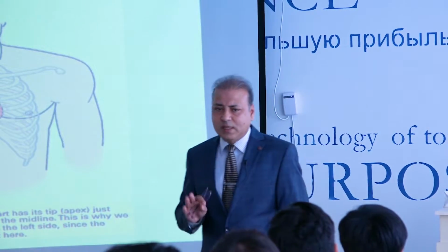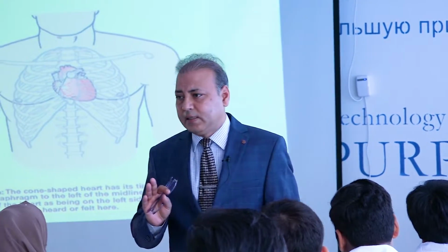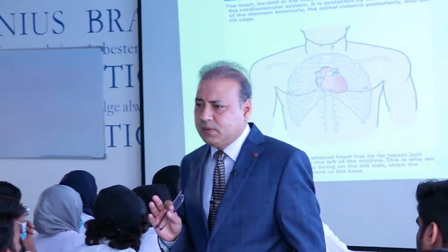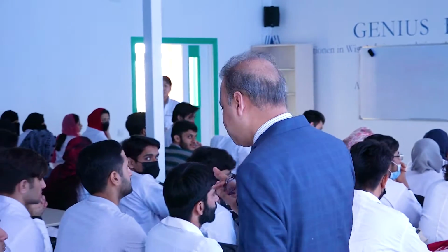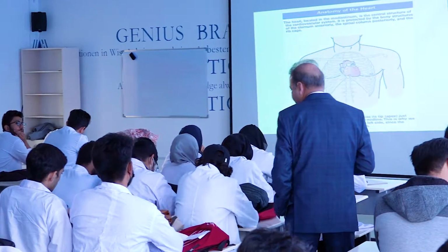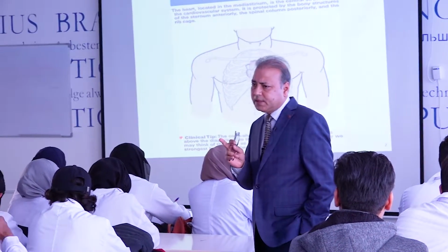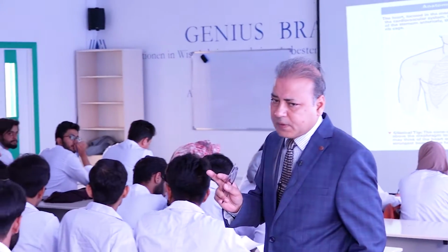We will talk about the heart and the conducting system of the heart. Because when you write an ECG conclusion, you have to know some points. First, write down: when an ECG paper comes to you, first you have to know the speed of the paper. The speed may be 25 mm per second or 50. How to calculate the speed of the paper?